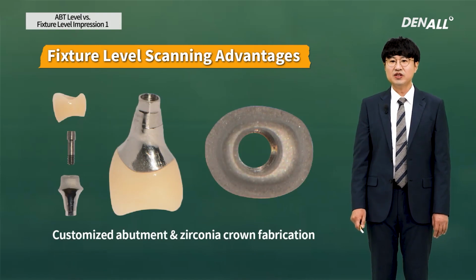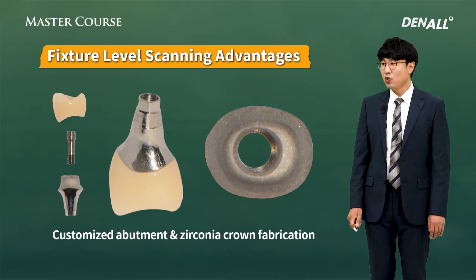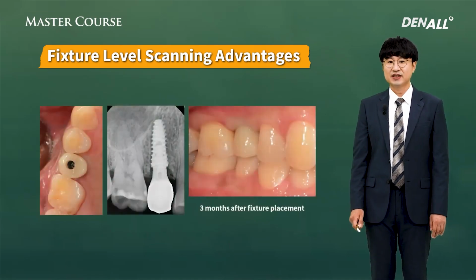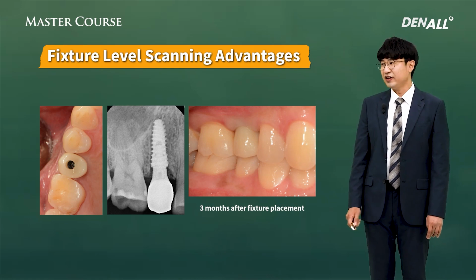As Osstem was creating a one-piece abutment, the zirconia crown was fabricated at the lab simultaneously. As it was done together, the advantage is that you can save time. Through digital scanning, the final prosthesis looked like this. The contact and occlusion seem to be all good.